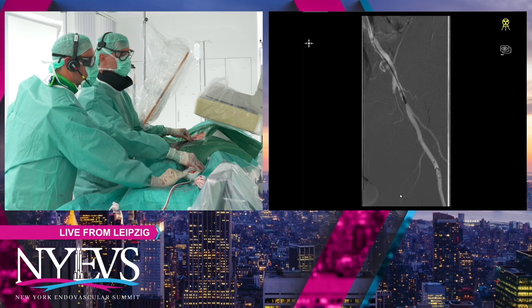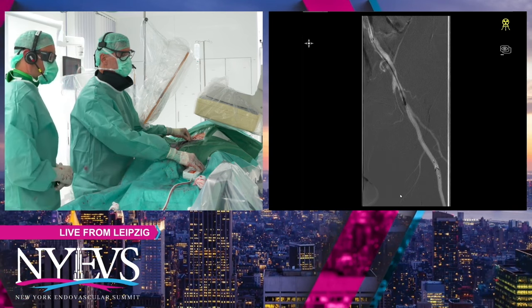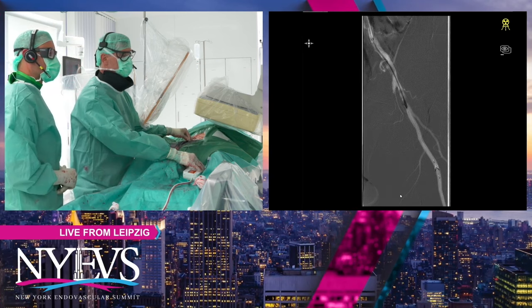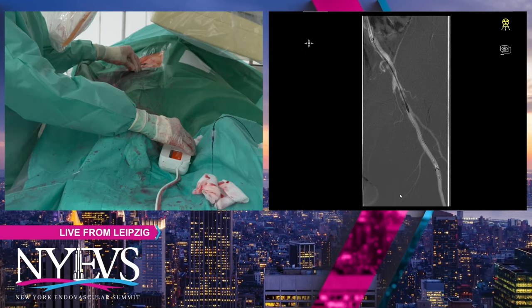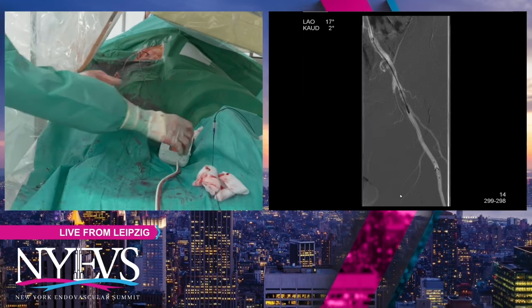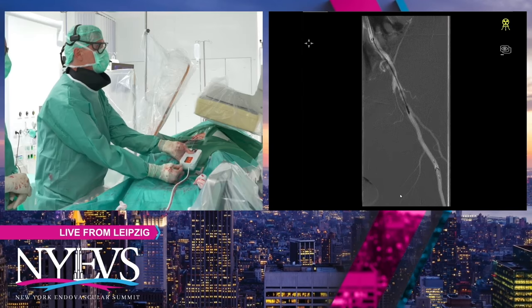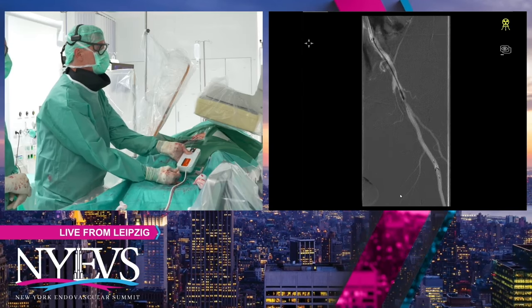From the PAD3 data, if you look internally at their data and their angios, they did a fair number of circumferential calcifications, but they also had some coral reefs, and it works pretty well. Again, it's not so much lumen gain, which is obviously important, but it's really cracking calcium, and then risk of embolization.